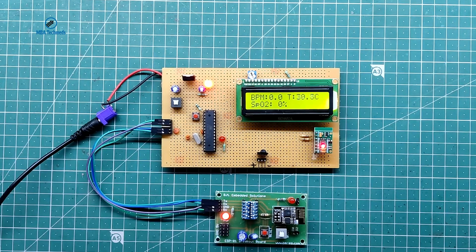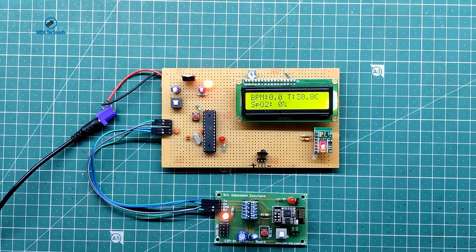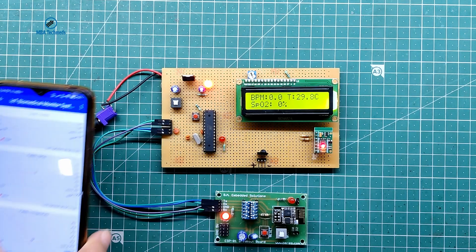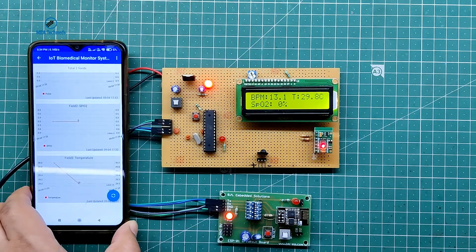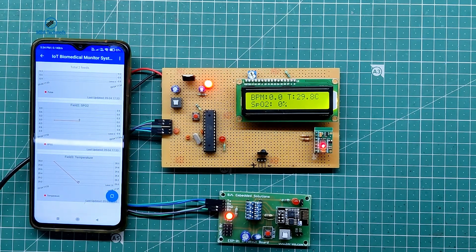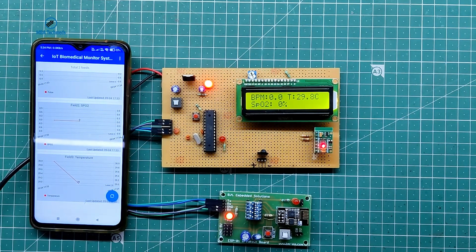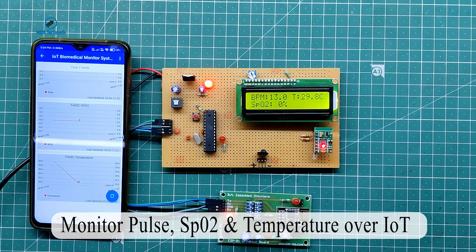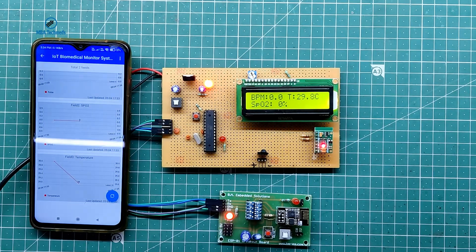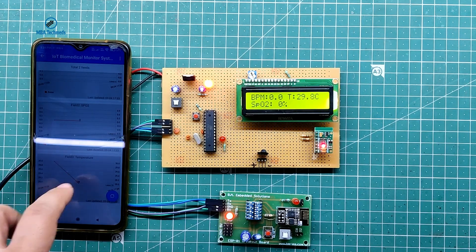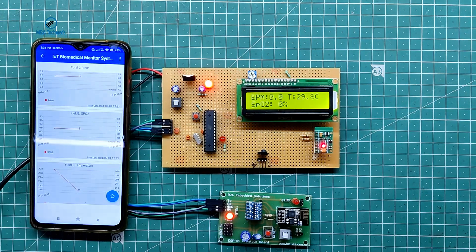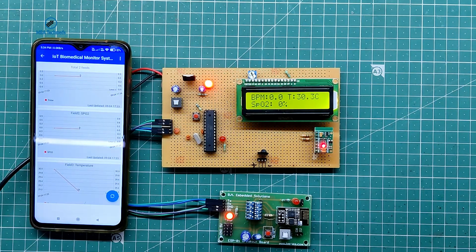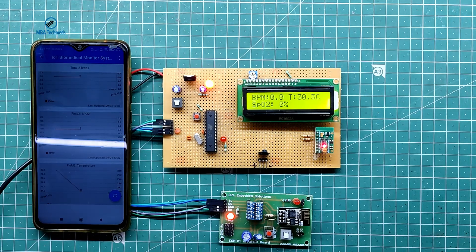Hello friends, this is the demo of IoT Biomedical Monitoring System in which we will be monitoring three biomedical parameters: Pulse Rate, SpO2 or Blood Oxygen, and Temperature, uploading it to an app in real time which will show graphical values.